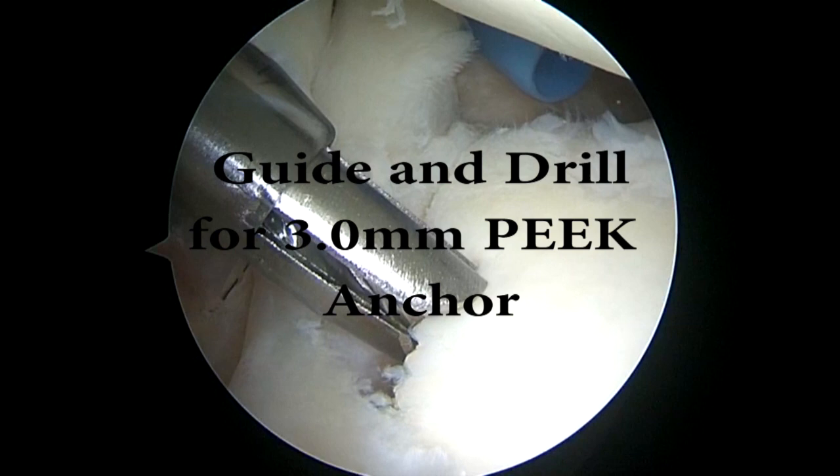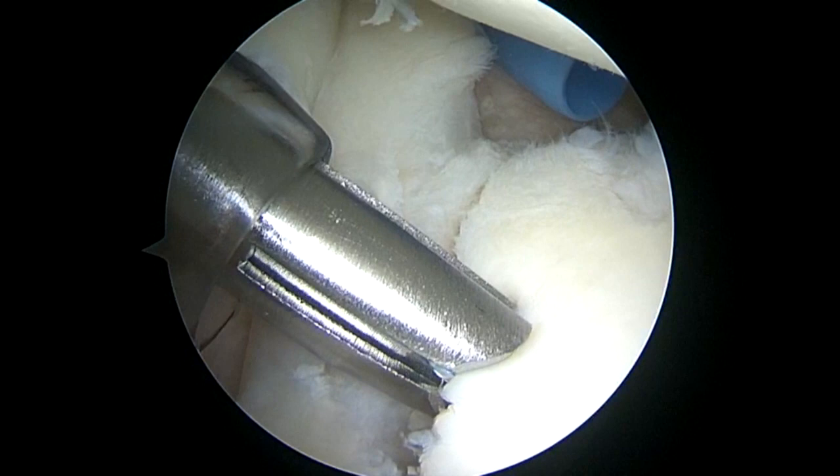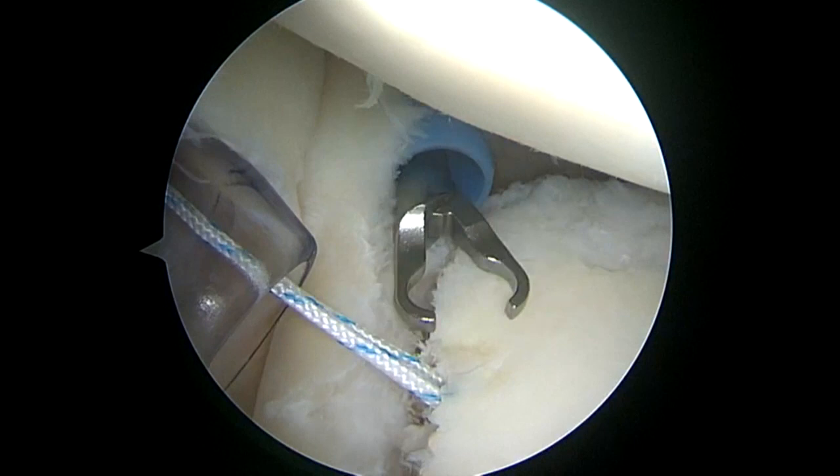I'm going to insert a guide and a drill for the 3mm peak anchor. We're punching in the peak anchor, which is loaded with 2 high strength sutures.